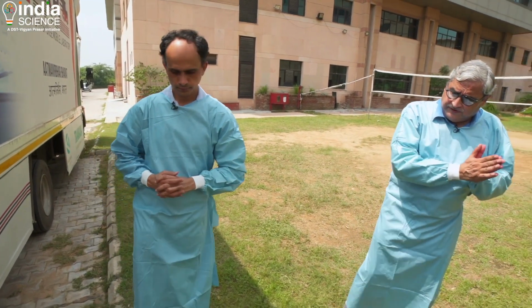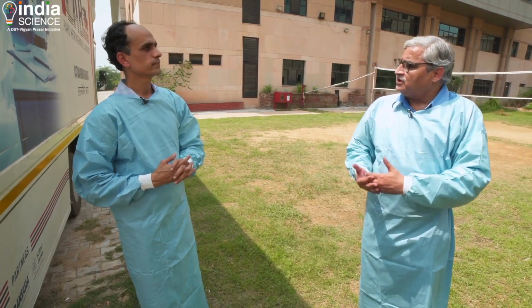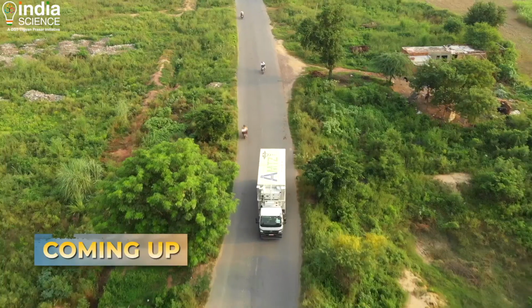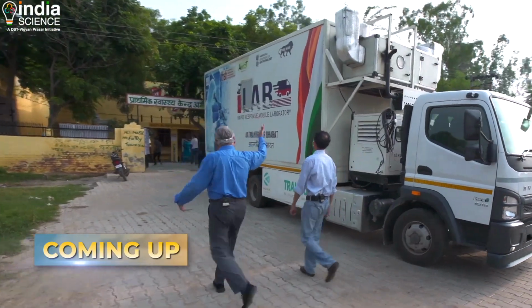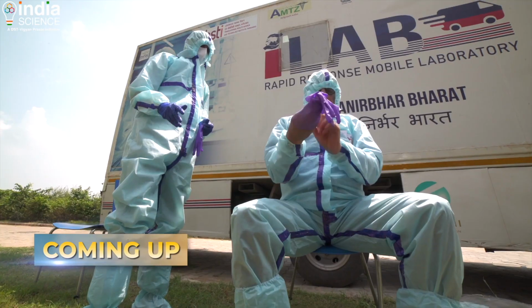So the more people we see as seropositive, that means we are heading towards more and more people going towards what would be called community immunity. Herd immunity is the right word. So that essentially says that the percentage of people who are exposed to the virus is slowly increasing, which indicates that the virus is probably spreading in the community. Now we will don a PPE kit.